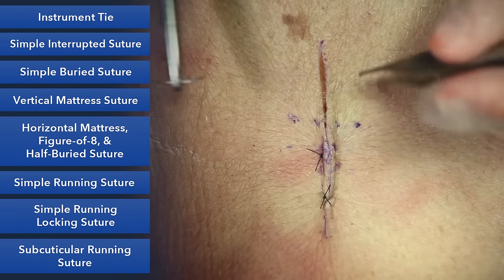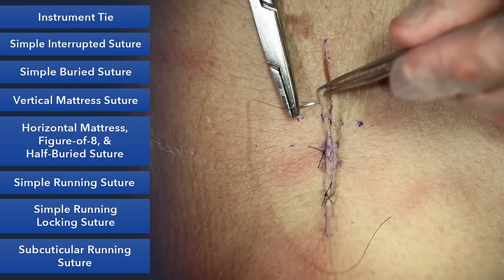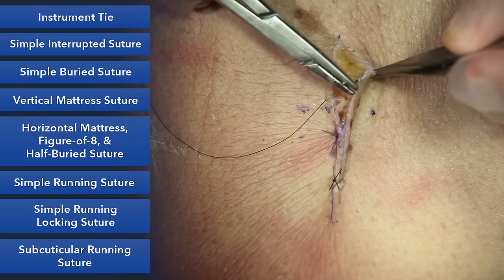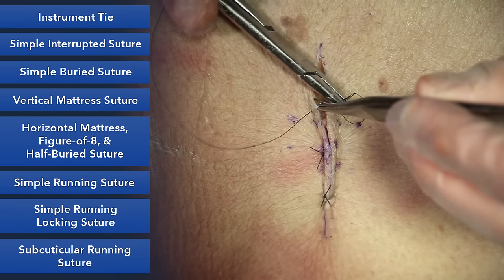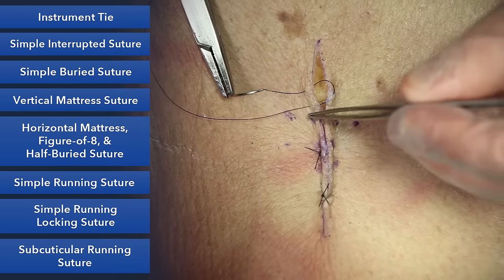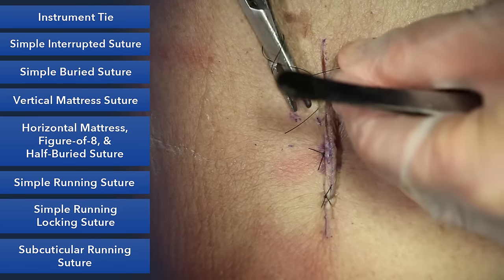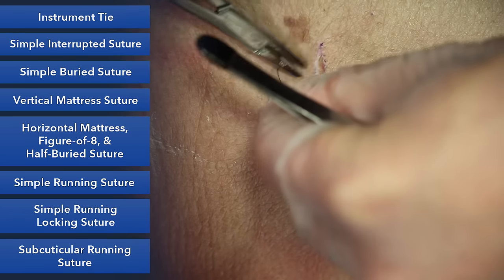And we use this a lot in plastic surgery. If there's an area where you don't want suture holes, you can actually start your horizontal mattress on one side, on the opposite side, stay within the dermis in a horizontal fashion, in a subcuticular fashion, and then come back on the other side, again, out like you would in a normal horizontal mattress. So effectively, it's your horizontal mattress, but half of it is buried, hence the name, the half-buried horizontal mattress. And when you tie this here, it'll secure the skin, and you only have suture marks on one side.